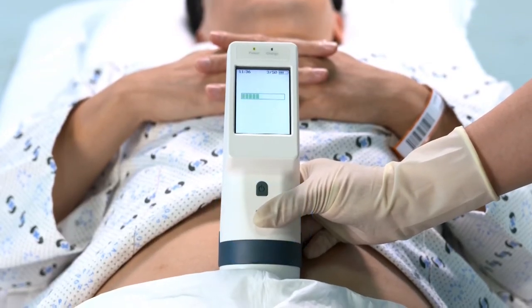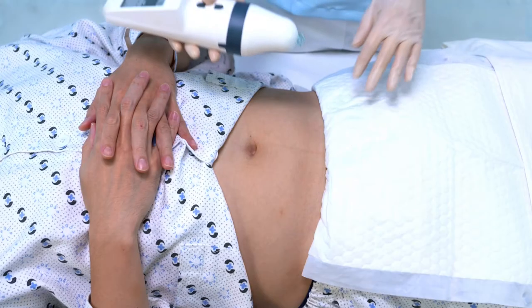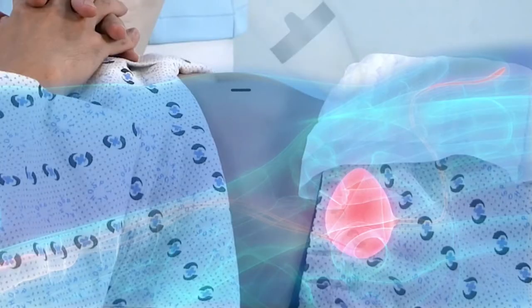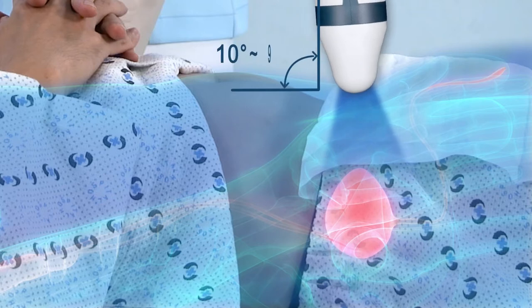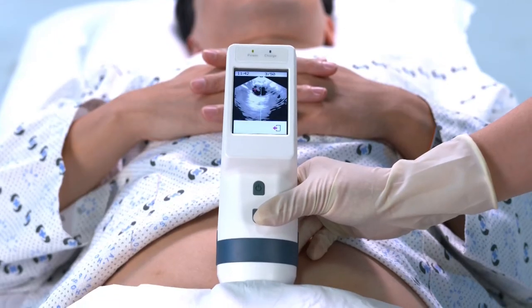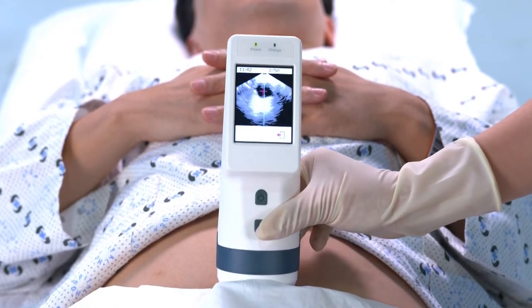Press the scan button on the probe or touch the scan icon on the screen to begin the pre-scan. Place the probe from the target location towards the bladder and slowly raise up until you find the biggest area of the bladder. Please make sure the probe should be lifted only up to 90 degrees from the abdomen.